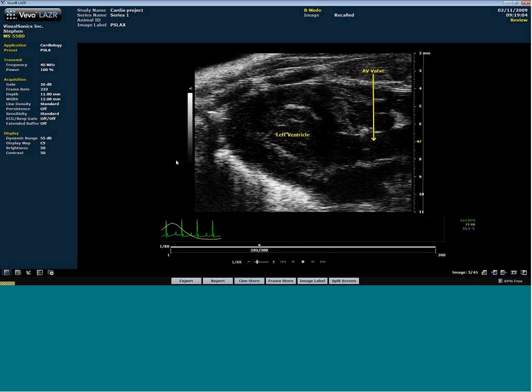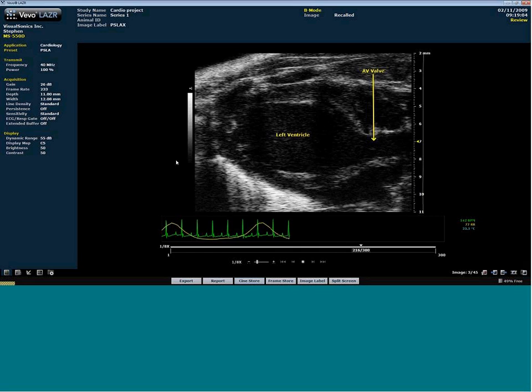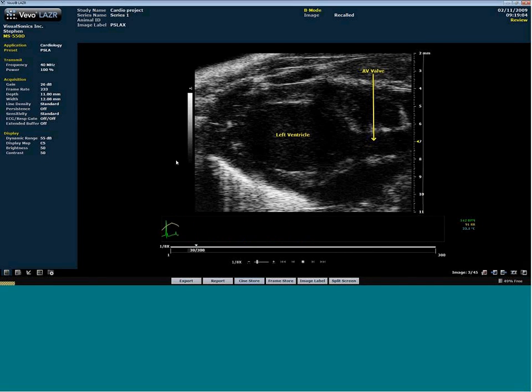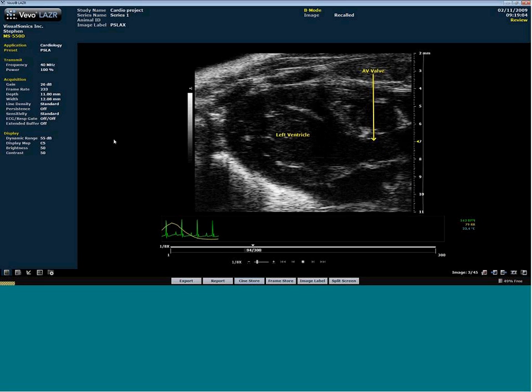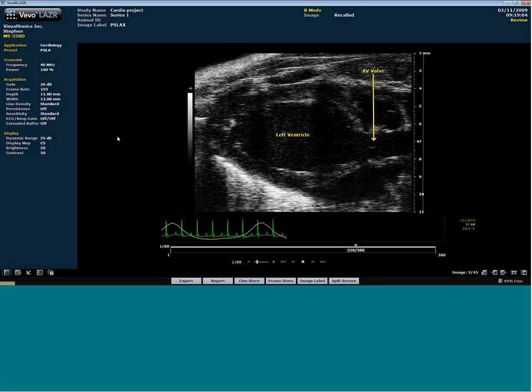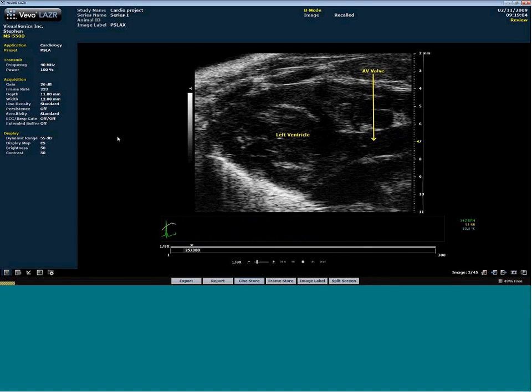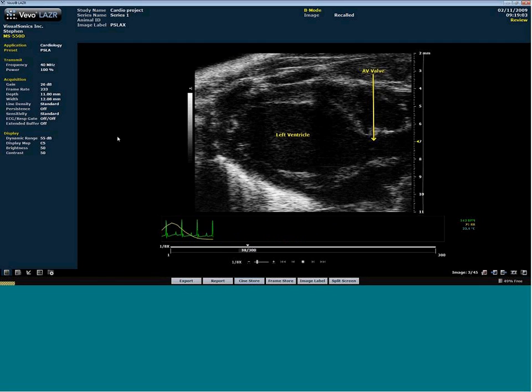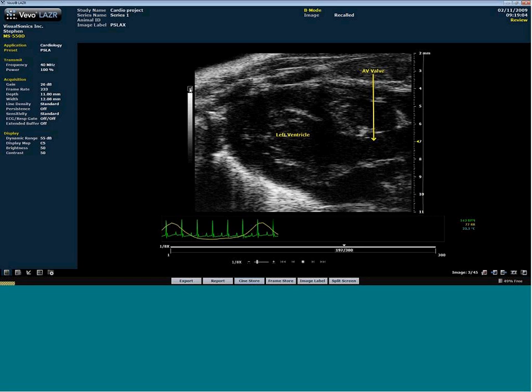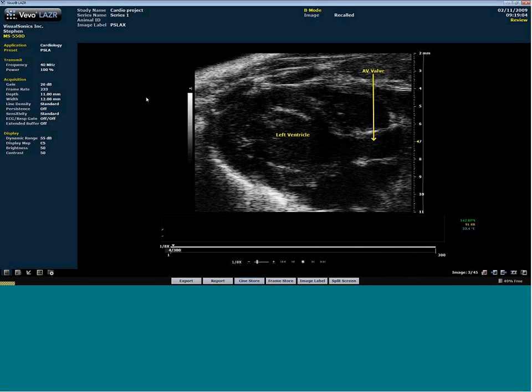In the Operator Preferences window, there's a set of buttons. One says Load Custom, Save Custom, and it saves a custom file that has the sector X, sector Y, and the TGC. It also has the global system gain setting, and I believe the left-right image invert is saved to that file as well.